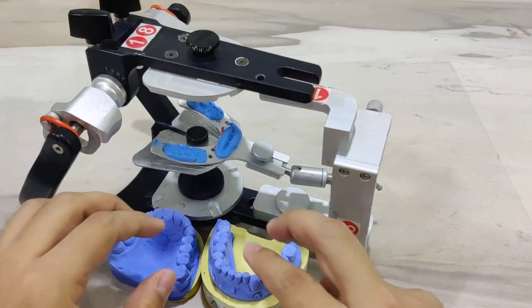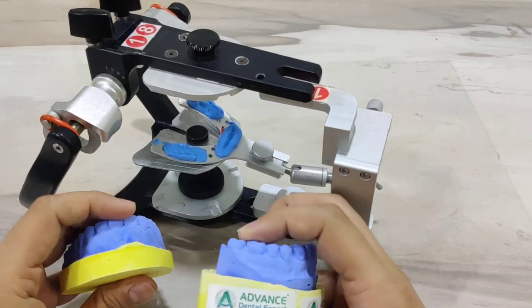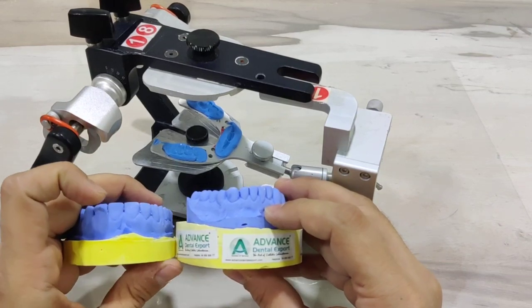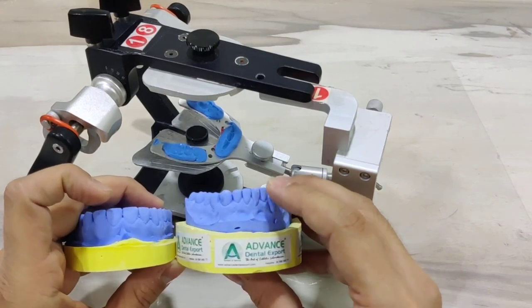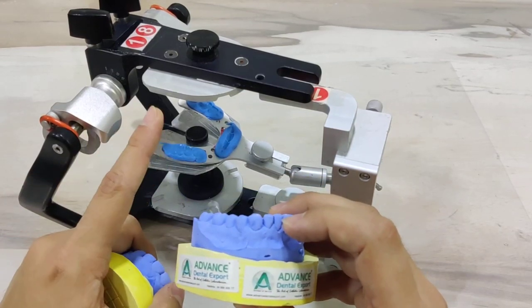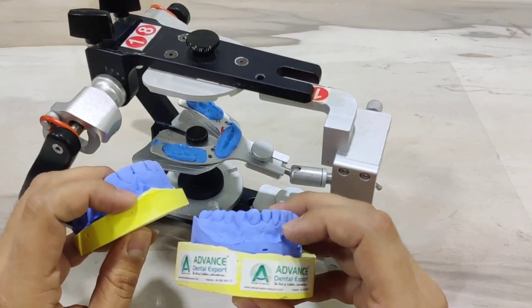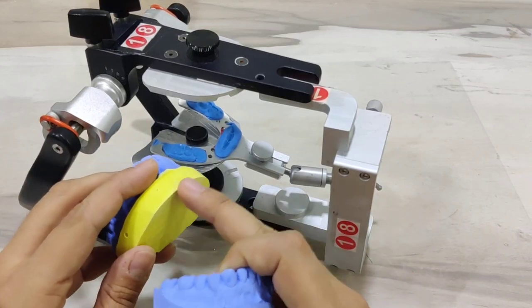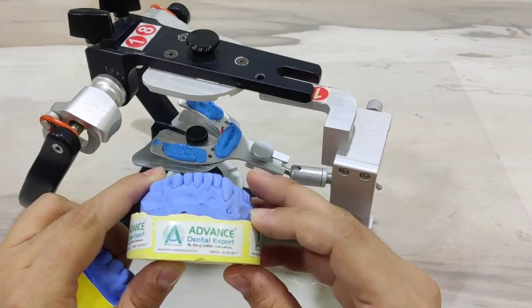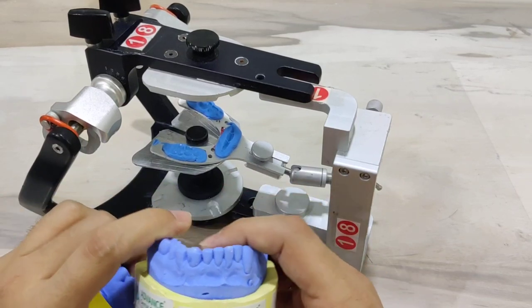Now very quickly let us look at the maxillary and the mandibular cast before we proceed with the actual mounting. In general, this is what I prefer for my technicians to do: keep the maxillary cast base relatively thin but keep the mandibular cast base quite thick. This is because usually the space available for maxillary mounting is less, so a thinner base is preferred. A thicker base often compromises the maxillary mounting, requiring trimming of the cast. On the other hand, a thicker mandibular base allows for easier mounting because the space available for mandibular mounting is substantially more.